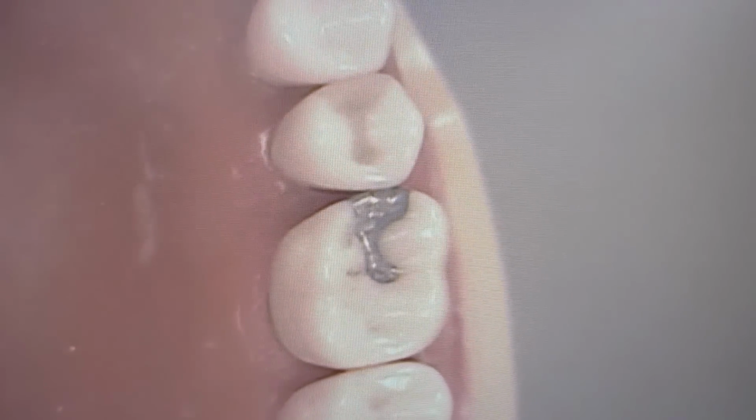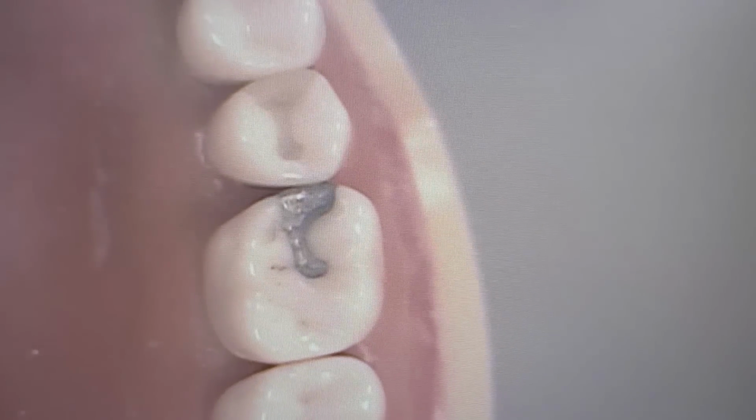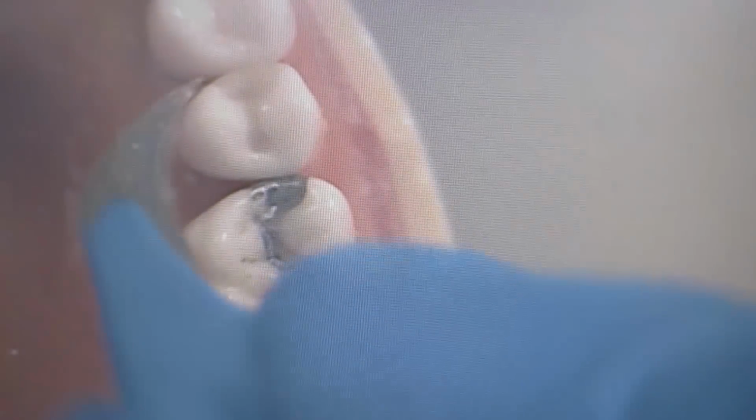Yeah, I think it looks good. It's still a little over contoured. Nice, fix it with the 12 blade.